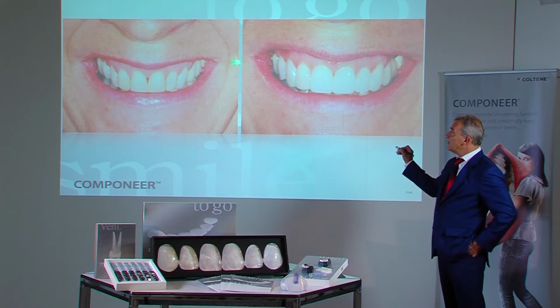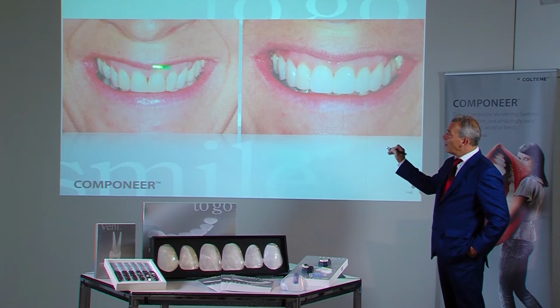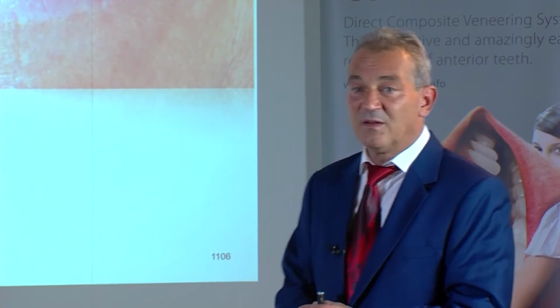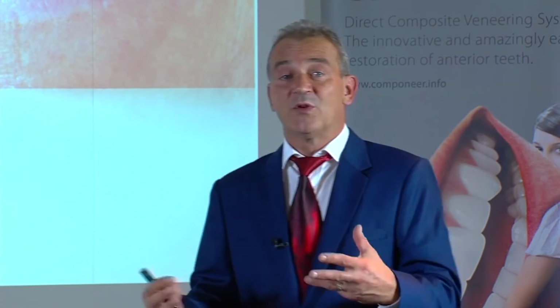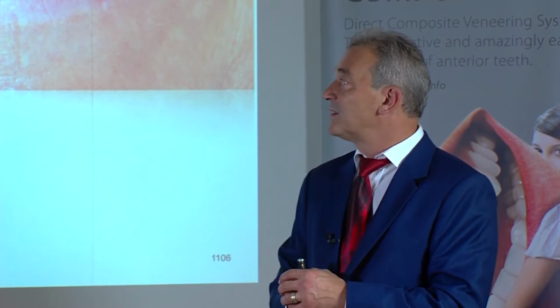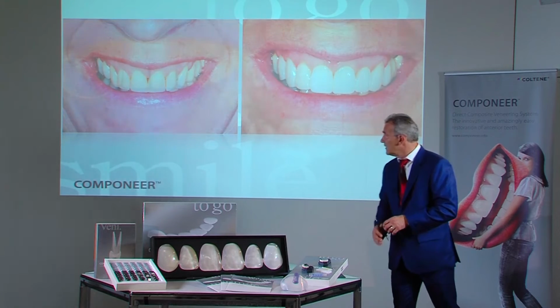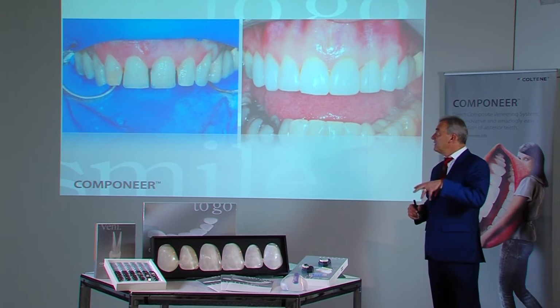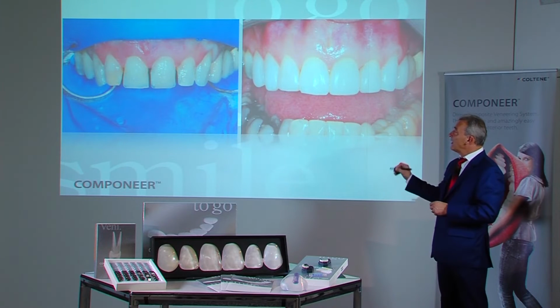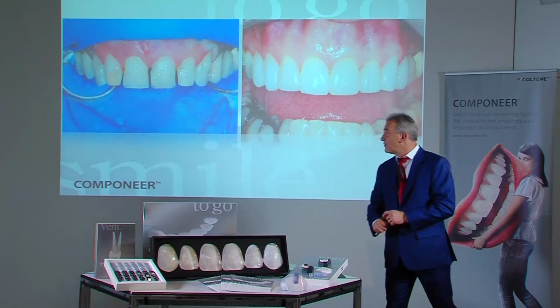In this case too, we have broad corners of the mouth. Actually, the premolars are missing on the left and right. This is why the entire jaw looks somewhat sunken. This often occurs following orthodontic treatment. For example, if the premolars are extracted in the maxilla and the mandible due to lack of space. Here we can view the diagnosis. At the same time, the old restorations at the surface are removed and the dental arch was widened slightly and rounded to create a more attractive situation.